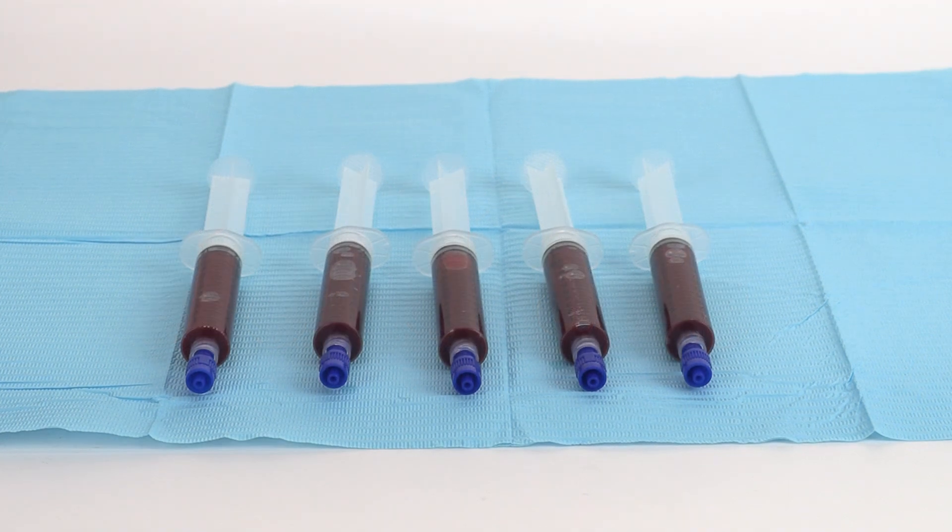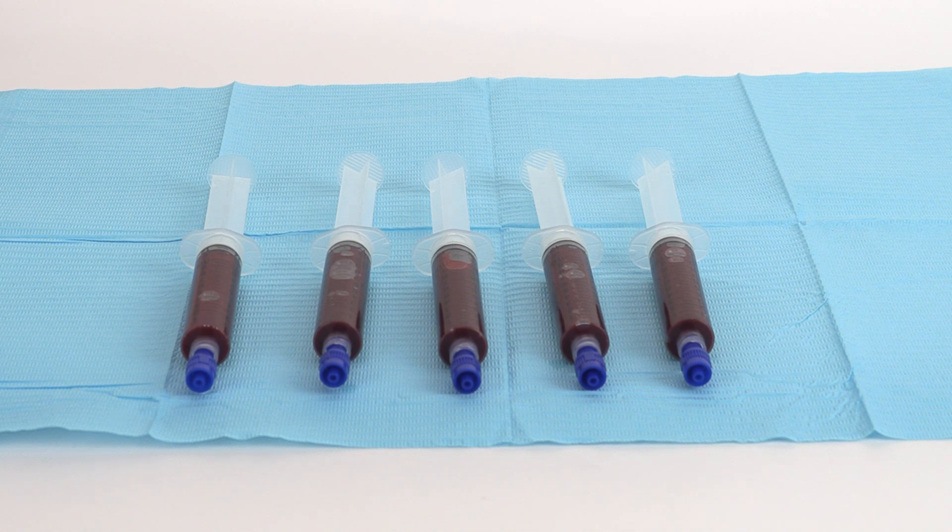Using standard technique, aspirate 11 milliliters of bone marrow aspirate into each 12 milliliter heparinized syringe, filling 5 syringes to 12 milliliters.